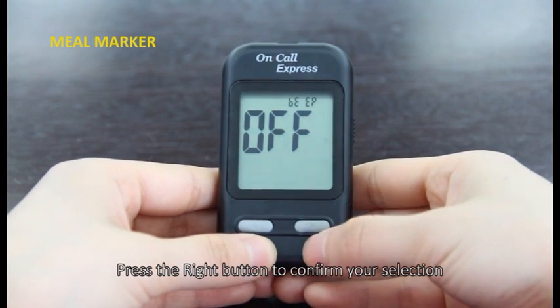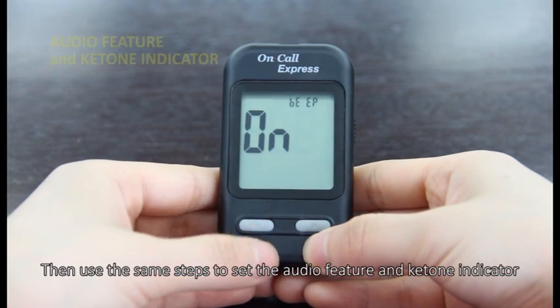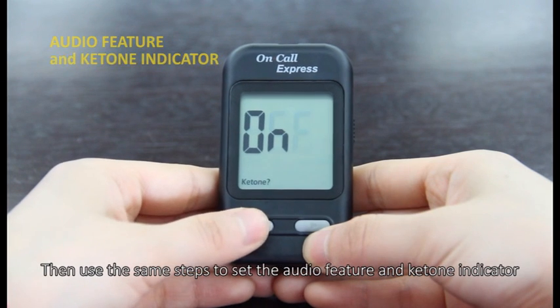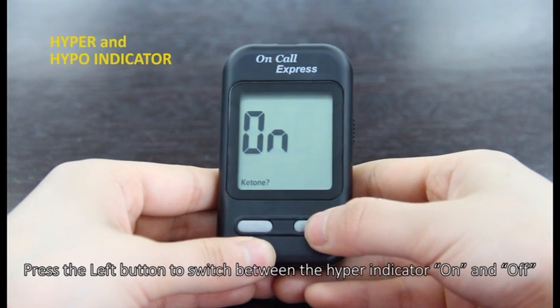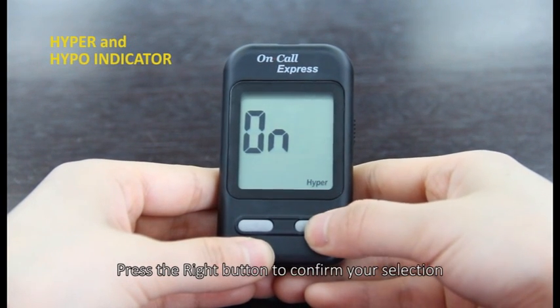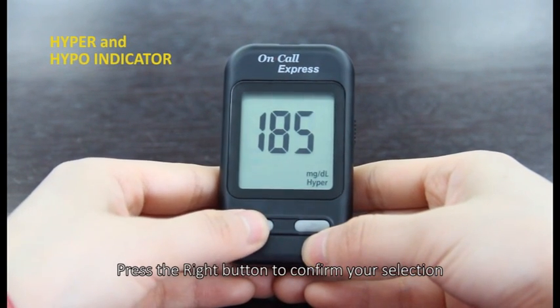Press the right button to confirm your selection. Then use the same steps to set the audio feature and ketone indicator. Press the left button to switch between the hyper indicator on and off. Press the right button to confirm your selection.